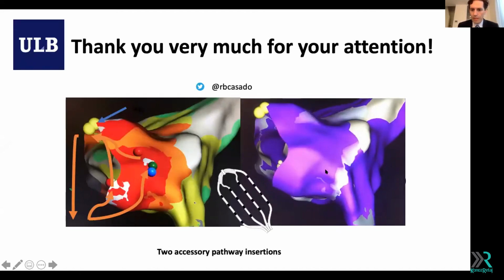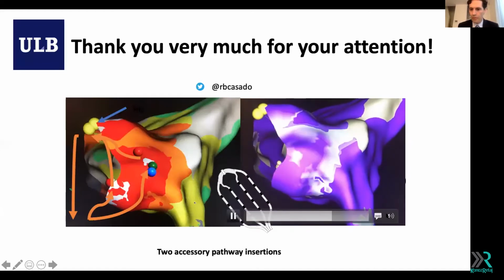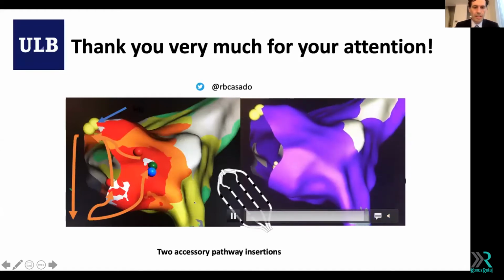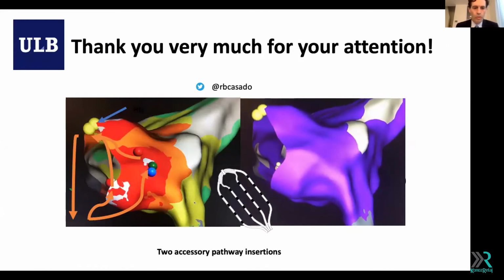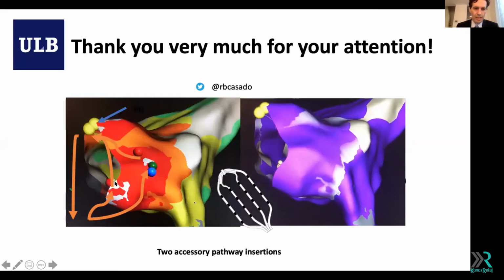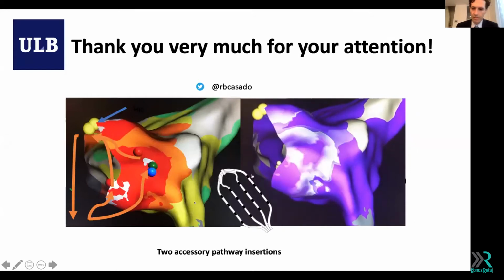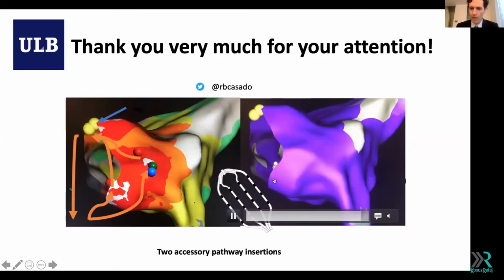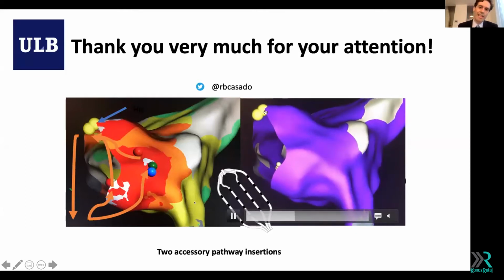I also would like to show you another accessory pathway that we did a few days ago. You can see here that this is a septal pathway with 2 insertions. We did this mapping during ventricular pacing, and you can see that you have 1 insertion here and another insertion 1 centimeter from there. You can see that the activation while ventricular pacing is at the same time in both cases. The His is a bit higher.